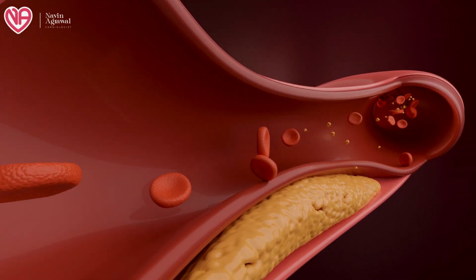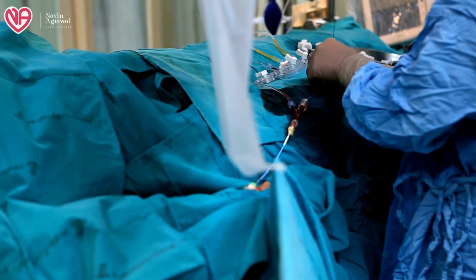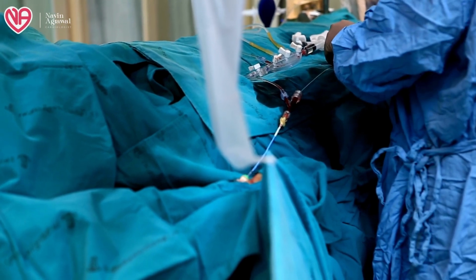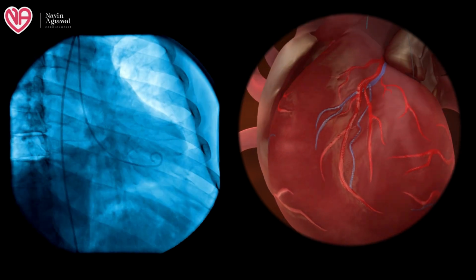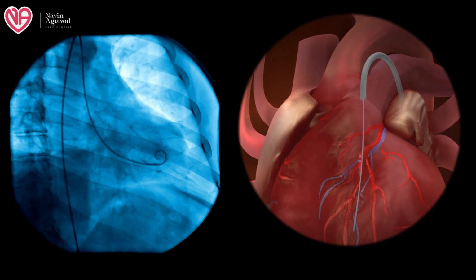In these places, whenever we cannulate the vessel, there are chances of slight damage to the vessel, and a 1 in 1000 risk of some adverse events can also occur to the patient whenever we are passing a catheter into the aorta. Some plaque which is present in the main vessel can also get embolized whenever it is touched by the catheter. So these are the few risks which are more in an invasive procedure as compared to a non-invasive procedure.